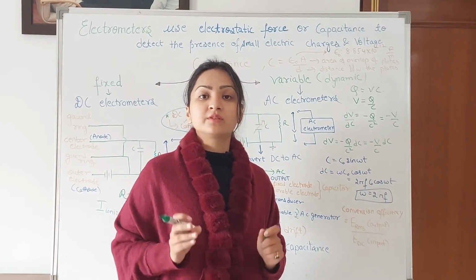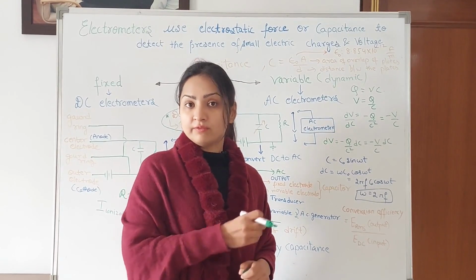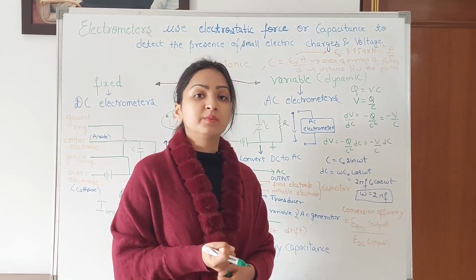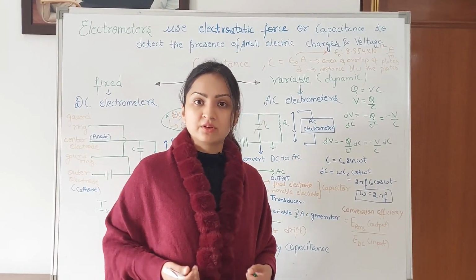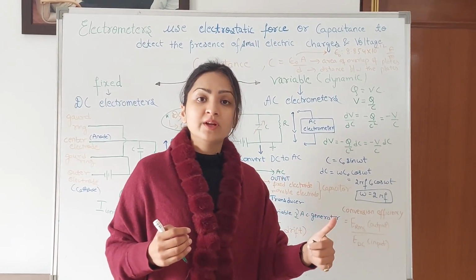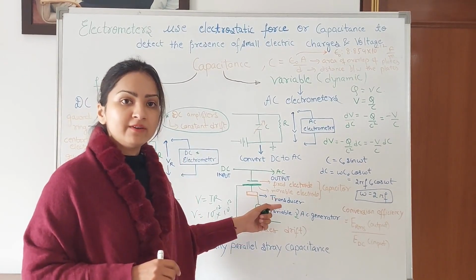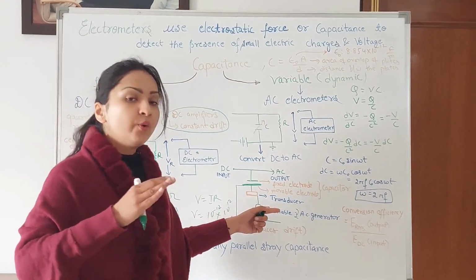Now the work of a transducer is to convert one form of energy to the other, and in the case of a ceramic transducer, we are converting electrical energy into mechanical energy. This force of bending enables these plates or beams to vibrate in flexural mode. So it will be like this, uniformly and constantly moving with the same frequency as the frequency of the variable AC generator. So this drives this transducer, and the ceramic element in this transducer is now vibrating.